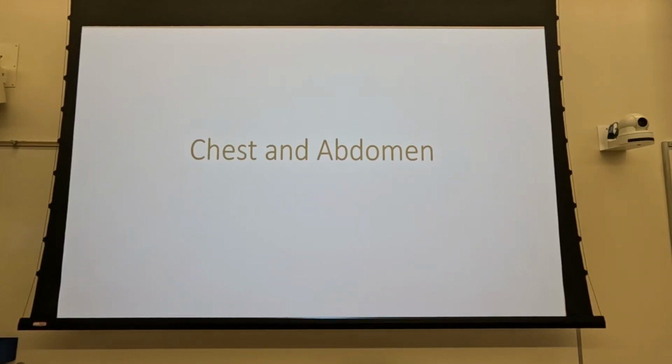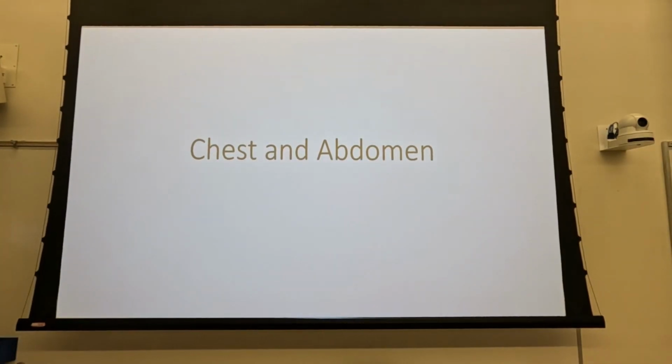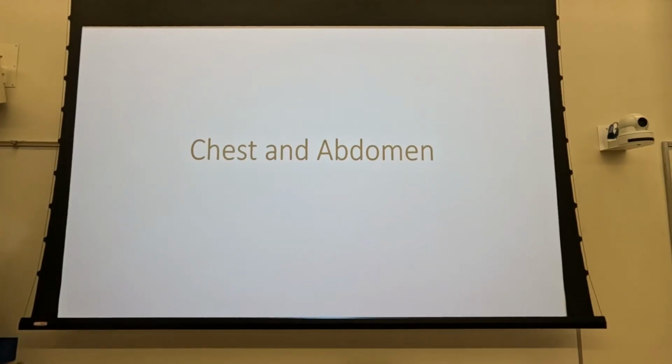All right, so, the first semester we go through positioning, basic positioning. And we're going to review all of that this semester, positioning for everything that we're going to cover this semester. We're going to talk about the textbook positioning out of Merrill's, but then we're going to dial in what it is that you have to do in order to correct for your image, if you have to go back in and take a repeat.